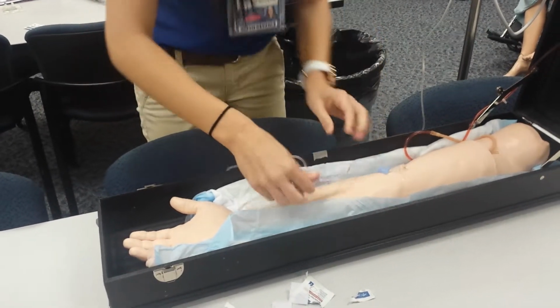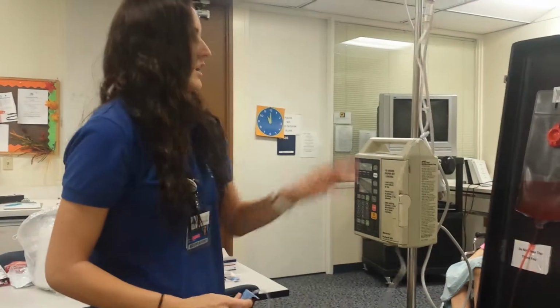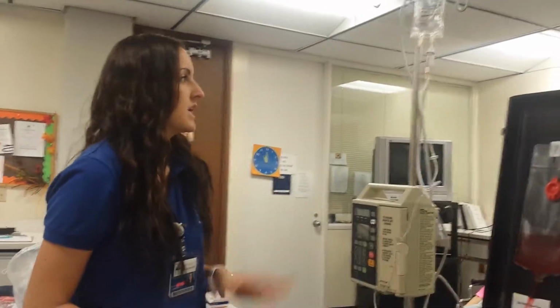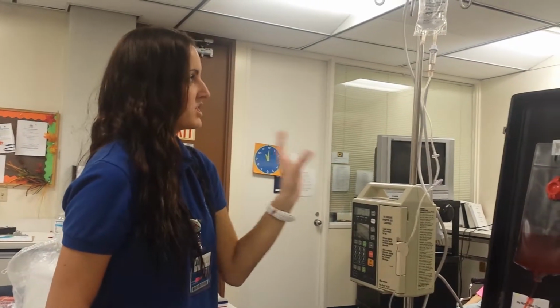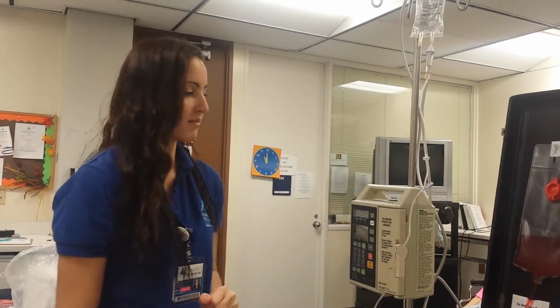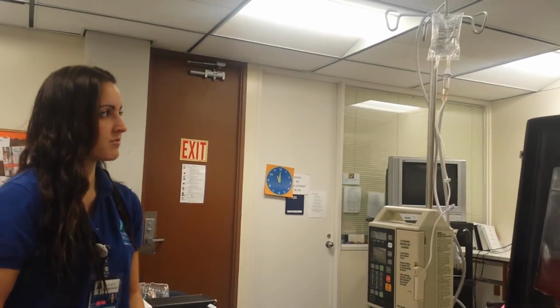to here. Now that that's in place, I am going to adjust my roller clamp to watch for 1 drop every 7-8 seconds. And then when I make sure that that is flowing at the right rate, I'm going to leave it in place and watch it for a few minutes, make sure it's running, everything's good, and the patient's not bending their arm or anything to occlude it.